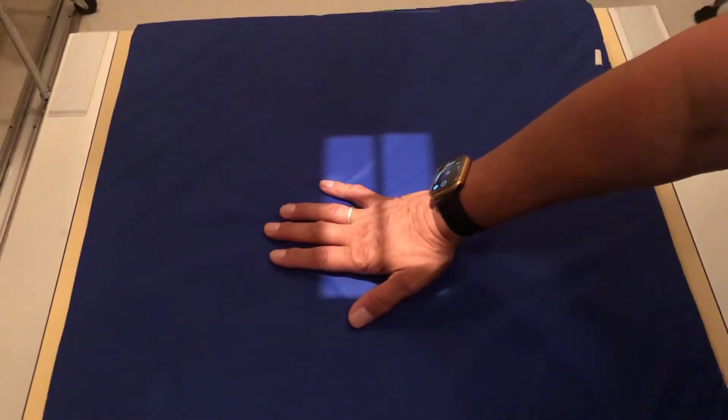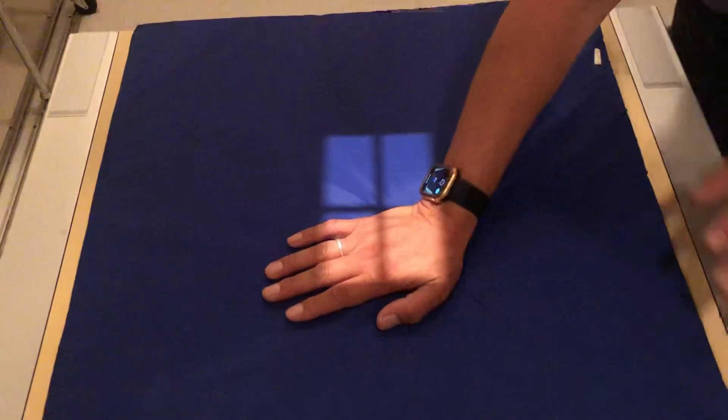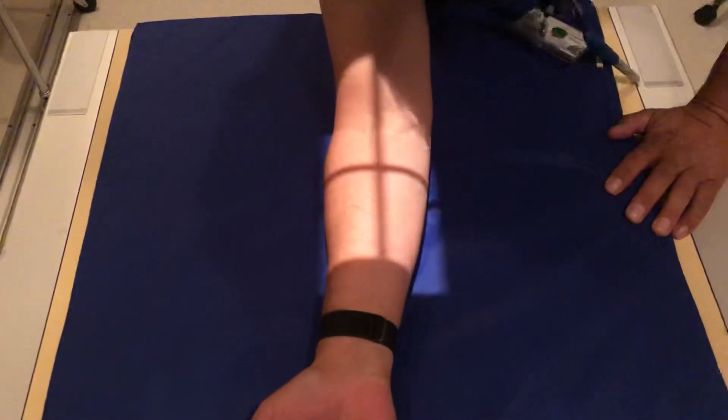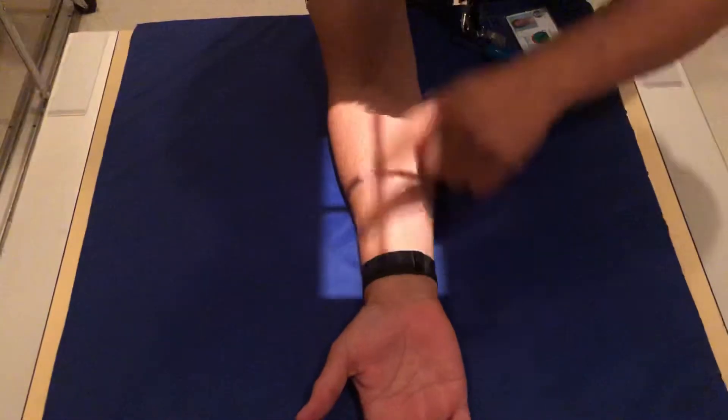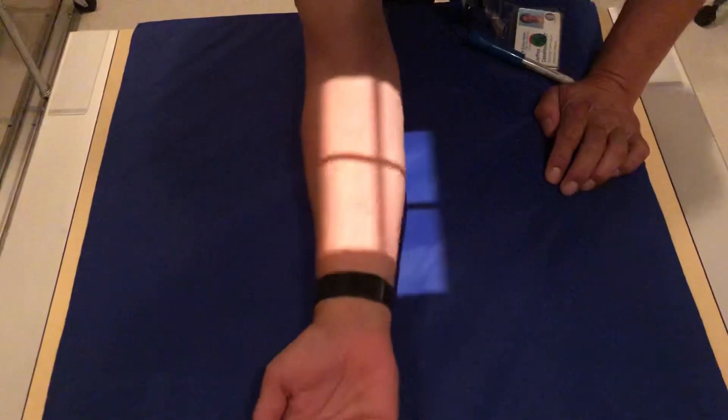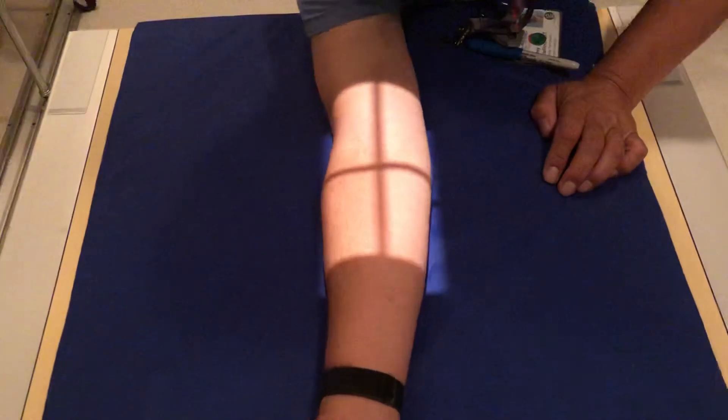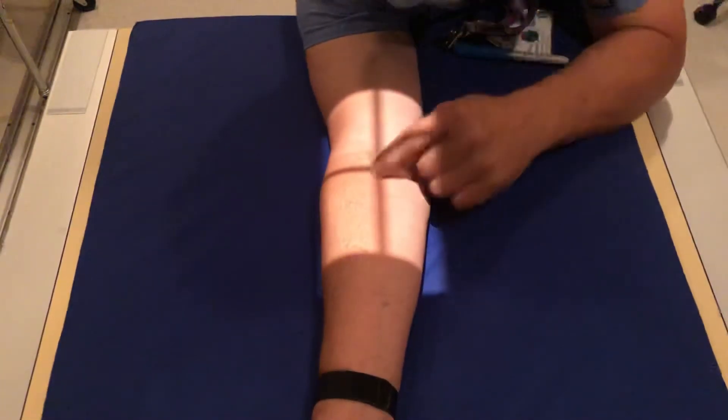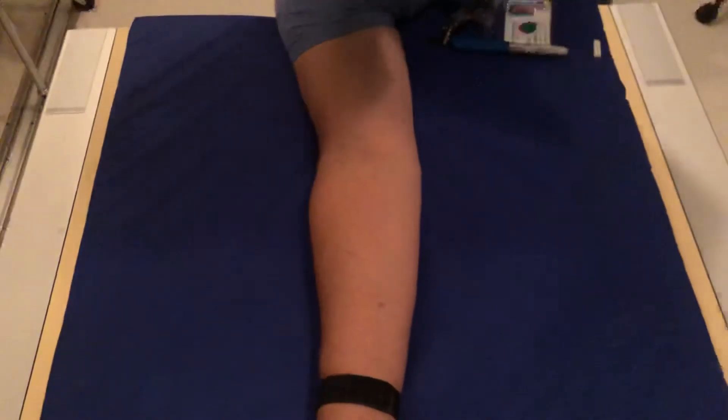and then a 90-degree true lateral. For the AP, you're going to want to make sure, just like the forearm, that the wrist, elbow, and shoulder are all in the same plane, and you're going to center right in the middle of the elbow there.